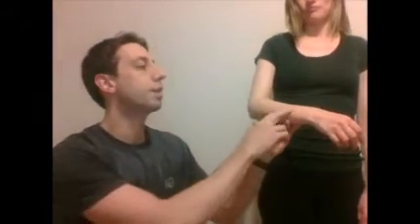Hi everyone, I'm going to demonstrate how to care for a patient who has a musculoskeletal injury or a potentially fractured arm. Imagine that we came across a patient that had a fracture. For the demonstration, we'll say that it's right about here on the arm, on the forearm, on the right-hand side.